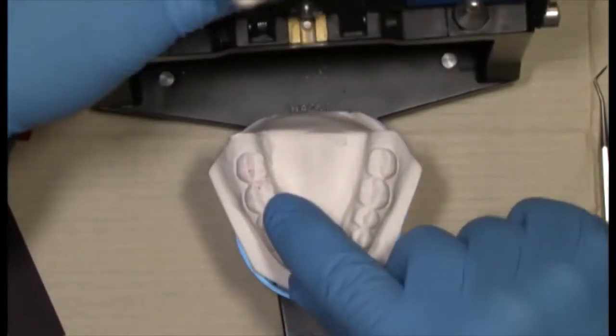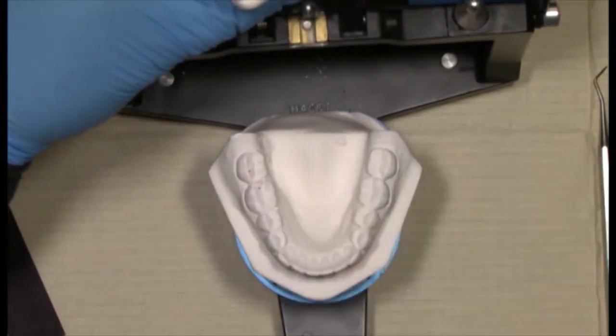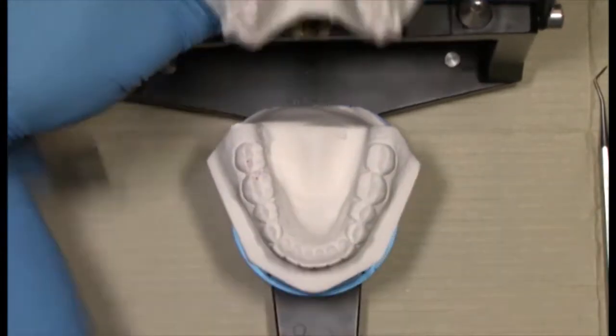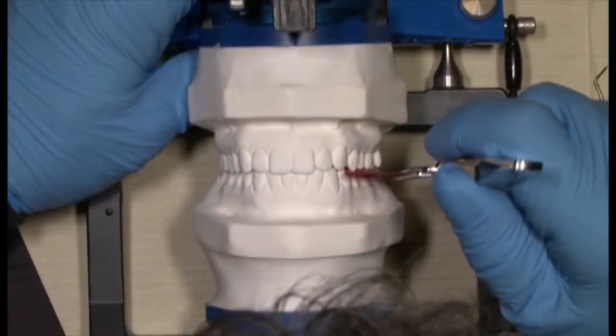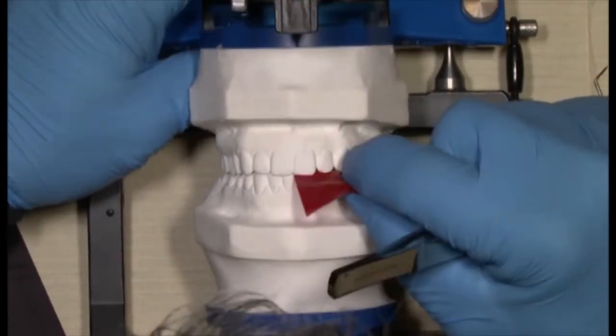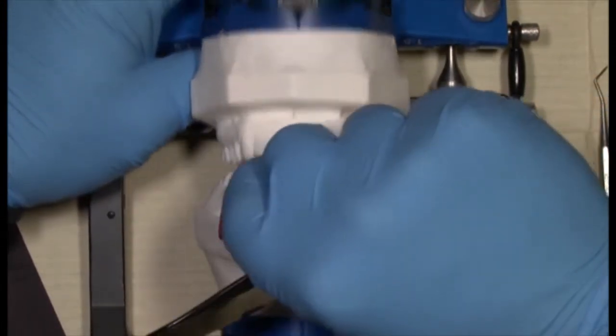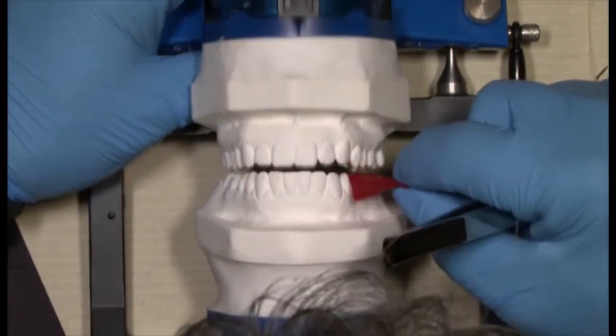So as we start to do it, you can see the dots starting to come on this right side. On the left side, when I close it, it doesn't really touch, right? You could see it just pulls out. And so wherever it's pulling out, obviously there's no contact.